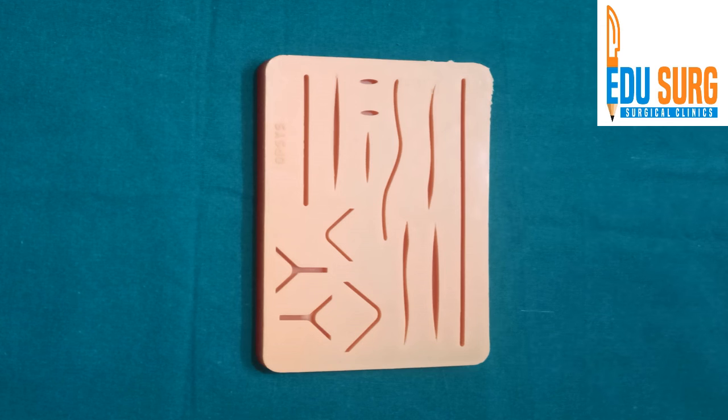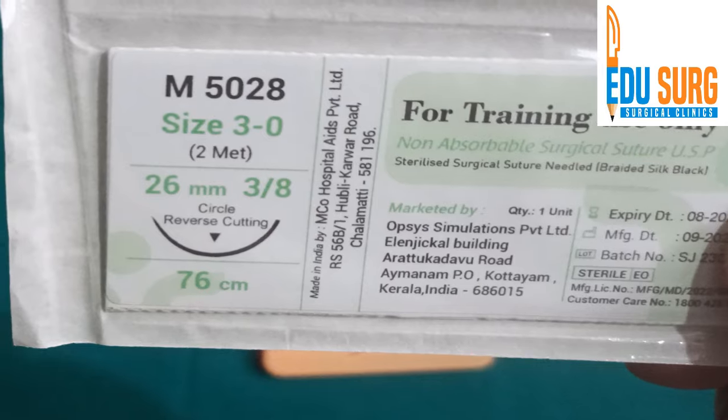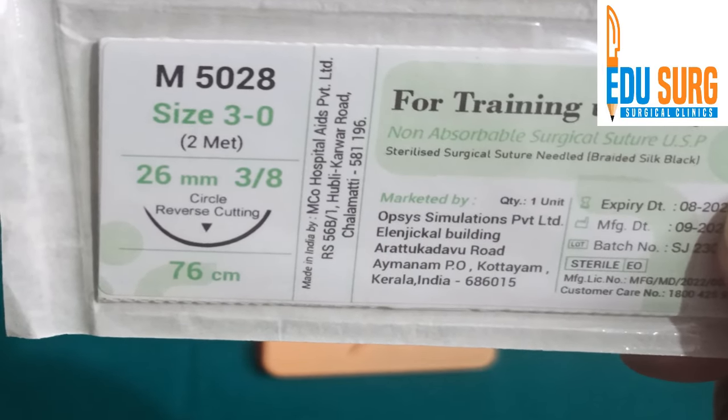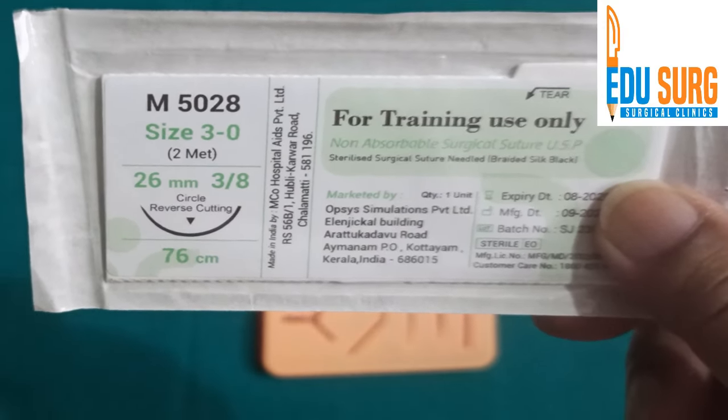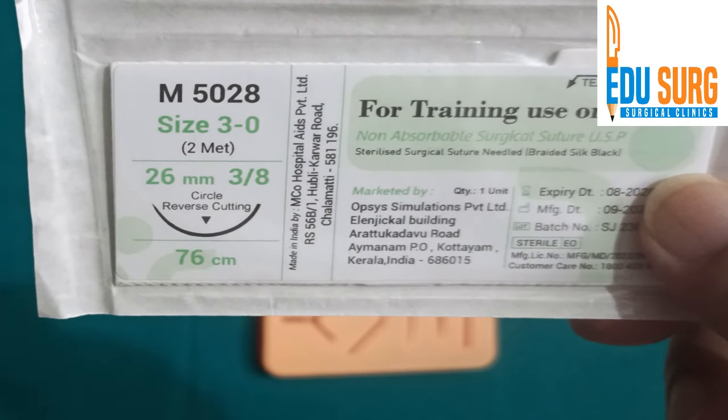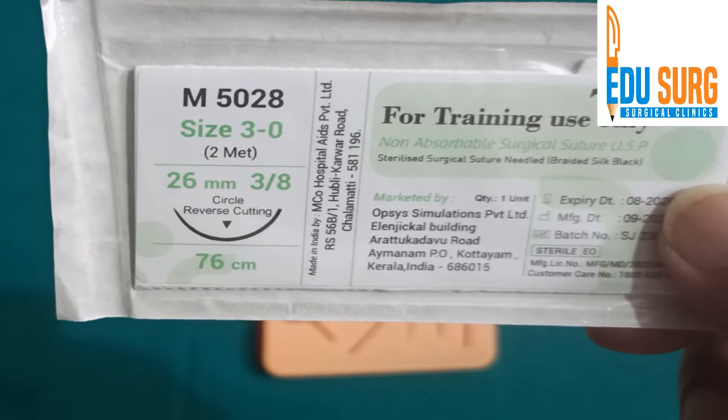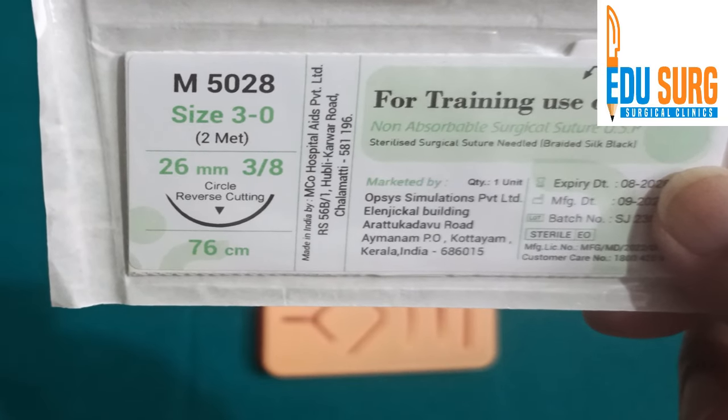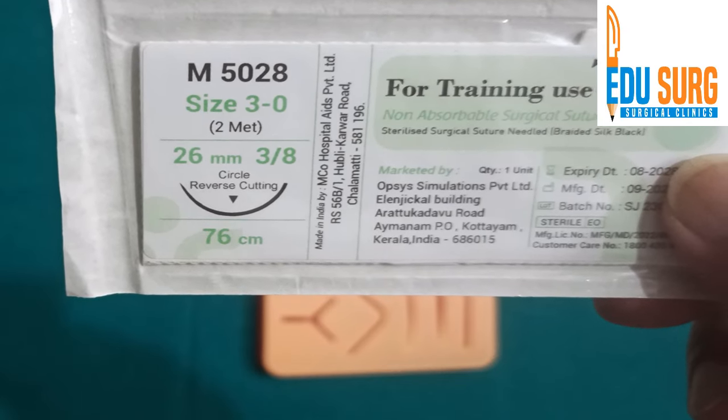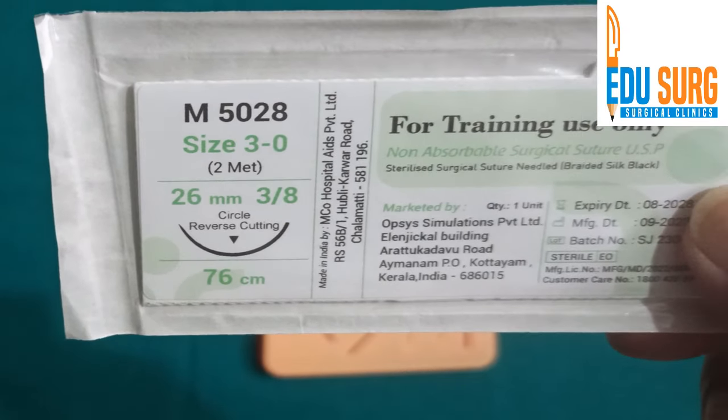Before we begin, let us see how to use the needle holder, how to remove the needle from the pack, and what are the different parts of a suture material that you see in your OR. So to begin with, we are going to use a 3-0 non-absorbable suture material. This is a braided silk black, it's a 3-0. The size is written as you can see. The needle is given by an inverted triangle, that means it is a reverse cutting needle, and the length of the suture is 76 centimeters. The needle length is 26 mm.